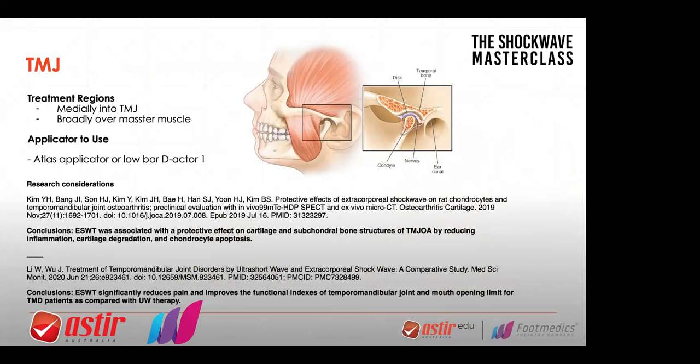I should also mention that shockwaving in this region can initiate a cough reflex, and you just need to know where your patient's reflex is initiated. Sometimes it's in the trap area, sometimes in the scalene area, sometimes in the neck, sometimes lower down. For some reason, those different points initiate the cough reflex in one person but not another — very odd. But you'll get patients that will cough and say 'I've got something in my throat.' It's from the shockwave, and it doesn't last. It's just a reflex that's been initiated.